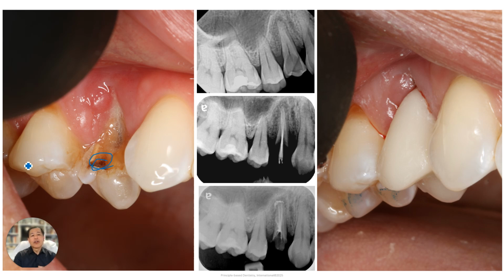So I got up in there. We did our rough prep. We got in there and we cleaned out this area right there where it was really soft. I could scoop all that tooth out. But I'll tell you, the core of the tooth was pretty good. It was intact. We got in here. This is actually the access to the lingual canal right here. The buccal canal was down over here.